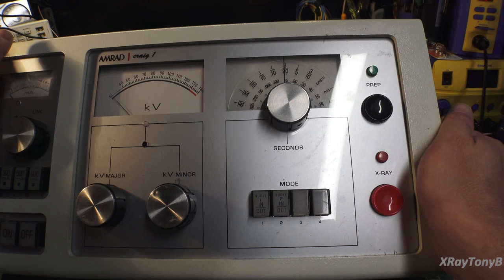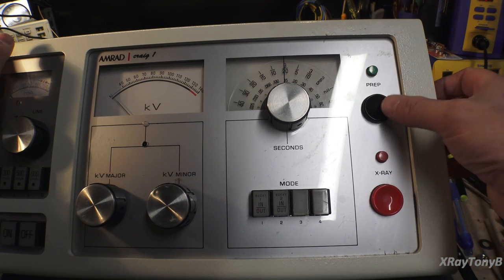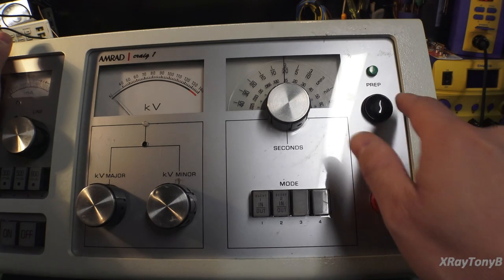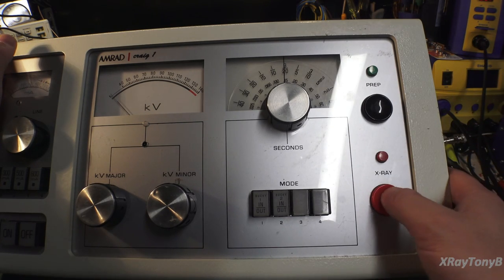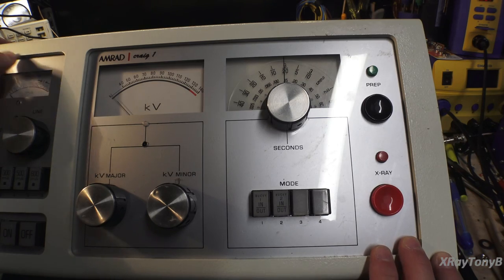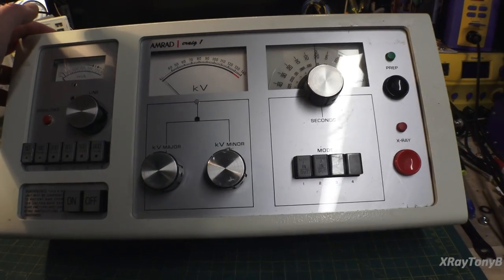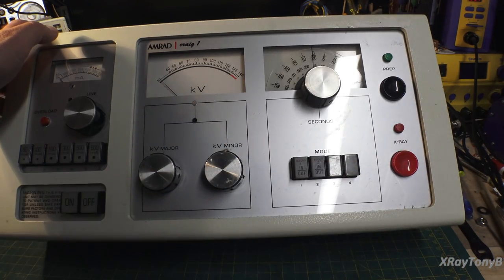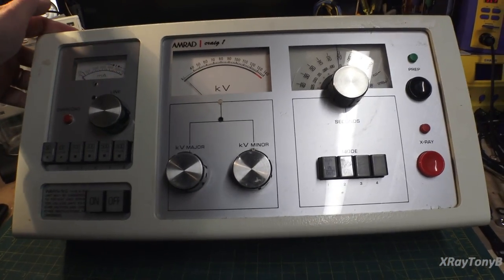So that's a very simple machine, and you have two buttons to make an x-ray exposure prep. We'll talk about those things later on. And you have the actual exposure button, the red button, to take the x-ray. Now, kind of an interesting fact is that the time and the current kind of work hand in hand.